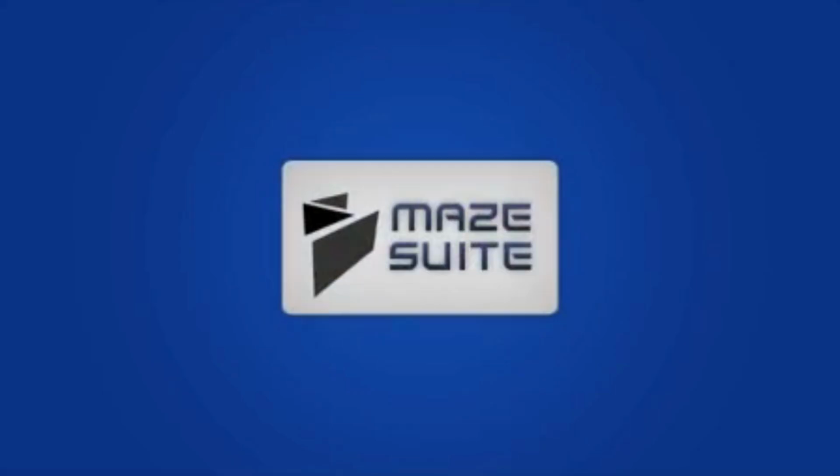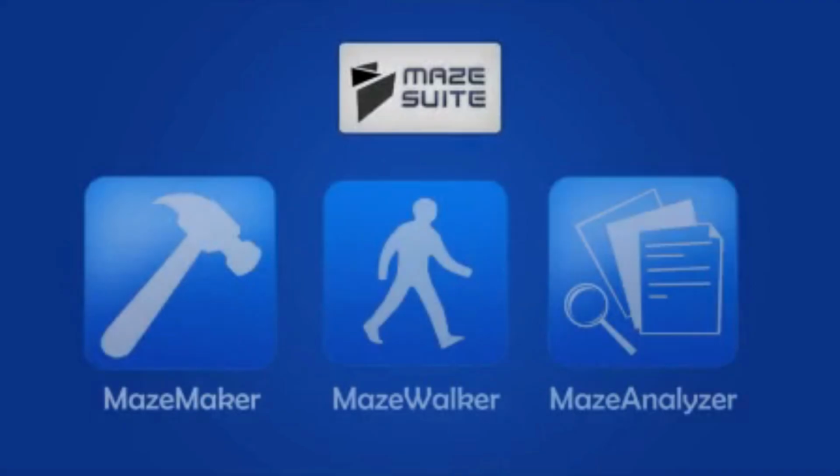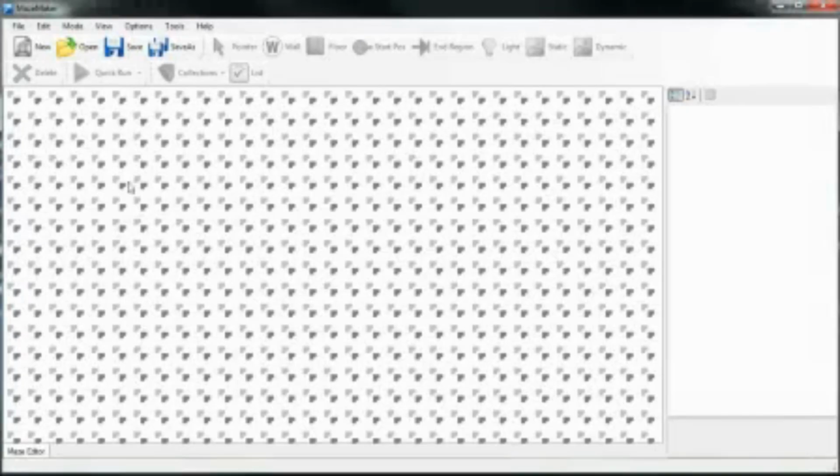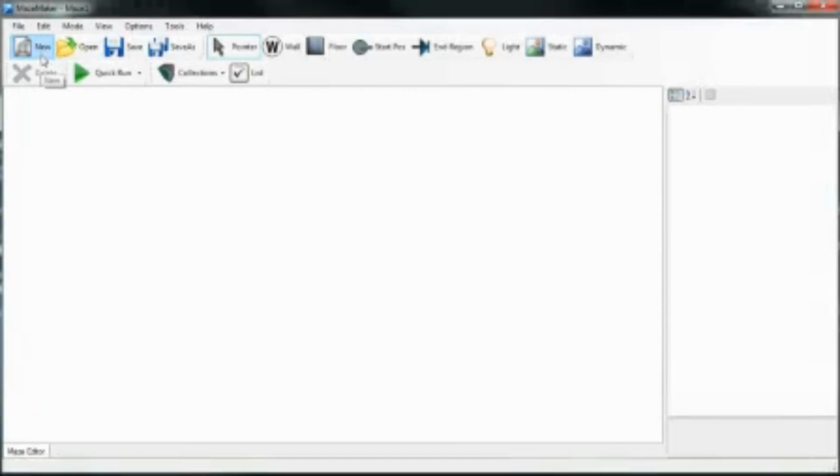MazeSuite consists of 3 components, each targeted towards a specific stage of the experiment: design, experimentation, and analysis. MazeMaker allows the user to easily design a 3D environment for each stage of the experimental protocol. Simple environments can be created in moments.